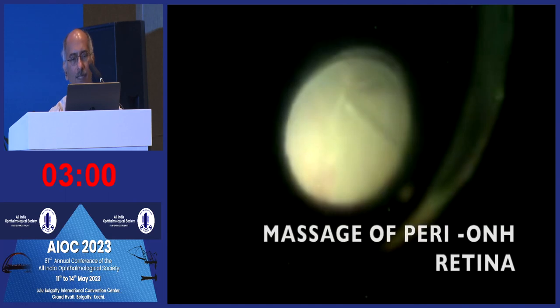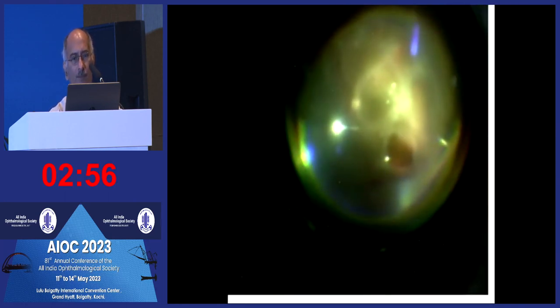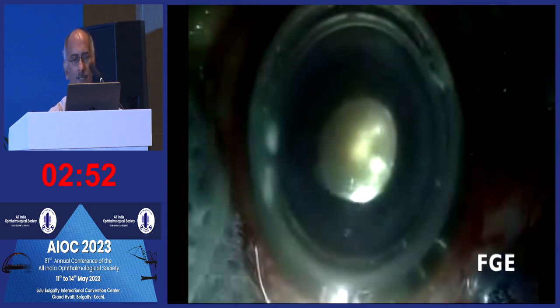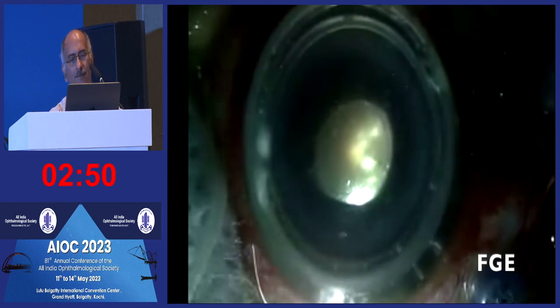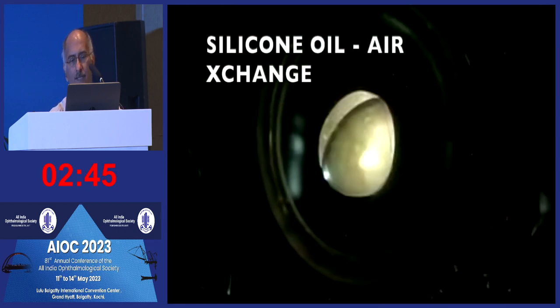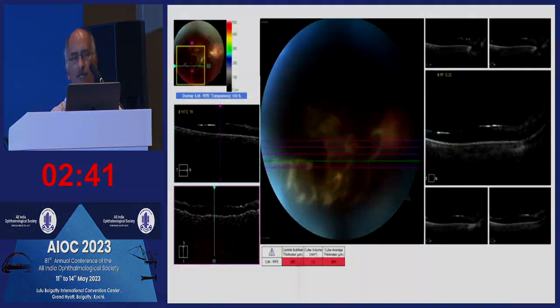So finally, I filled it up with PFCL, massaged the peri-ONH retina, endolaser, FGE, and then finally silicone oil, air exchange was performed. This was a pseudophakic eye, so to prevent.